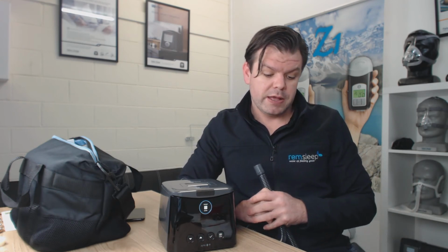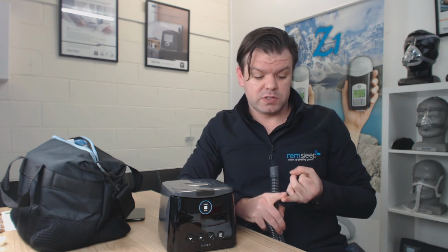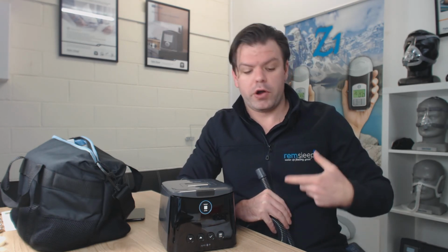Oh yeah, I'll talk about the app. The app is called SleepStyle. It's free. It will measure your leak rates, your apnea-hypopnea index, your hours of usage. You can compare averages over the week, the month, etc. And it records your progress and encourages you and gives you feedback and stuff like that. So that's pretty much it for it.